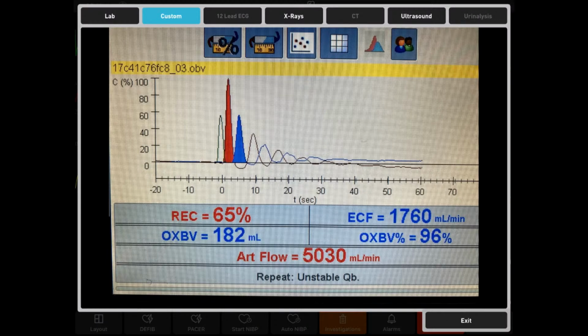Since we were talking about oxygenator blood volume, you can see on the left-hand side, that's where we input what the oxygenator requires for priming. In other words, what's its standard volume. And then you look to the right, and it tells you what's your blood volume percent. So there's nothing wrong with this oxygenator. It's correct. It's working fine. There's not clots. It's doing great.